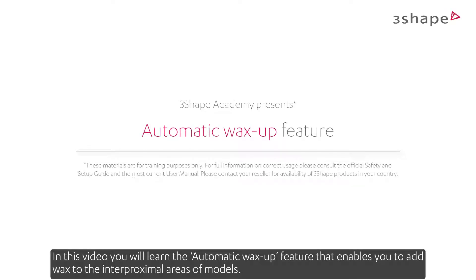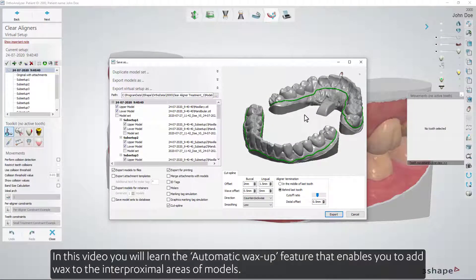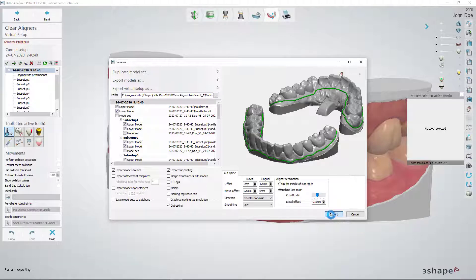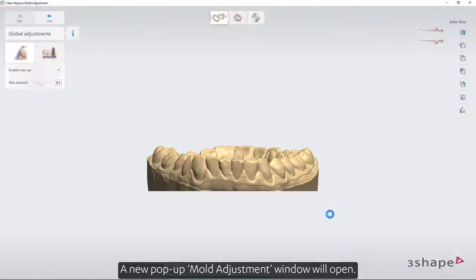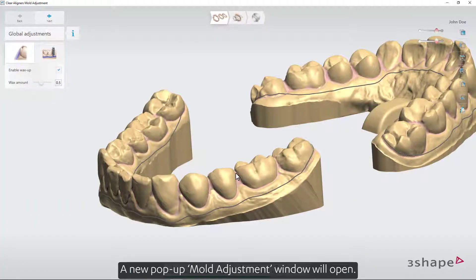In this video you will learn the automatic wax-up feature that enables you to add wax to the interproximal areas of models. When in the export window, you can edit all the settings that you need and then press export. A new pop-up mold adjustment window will open.